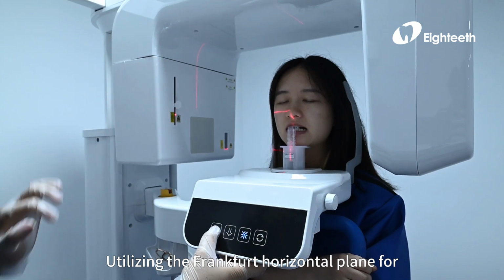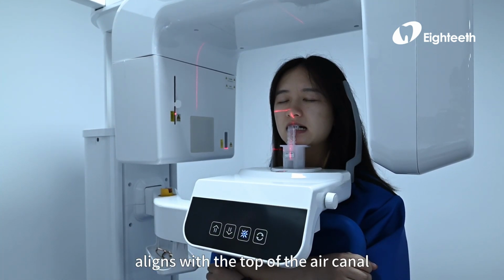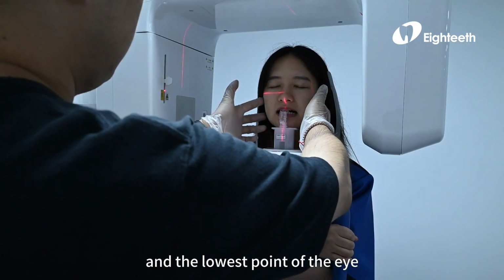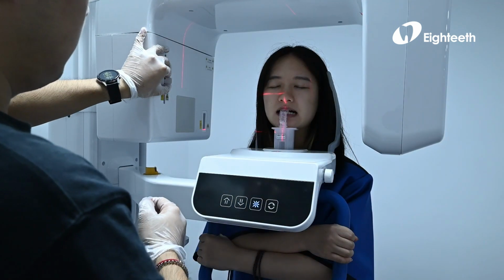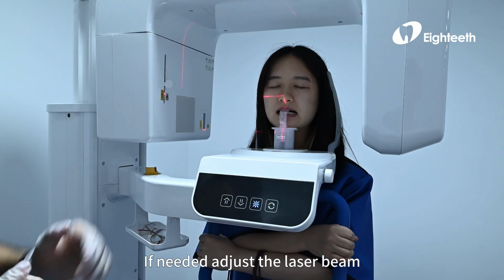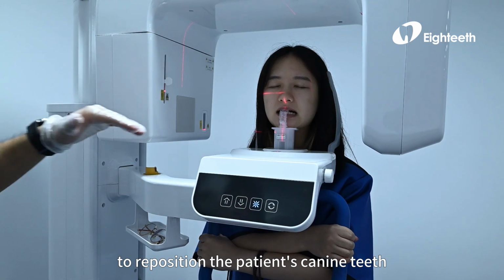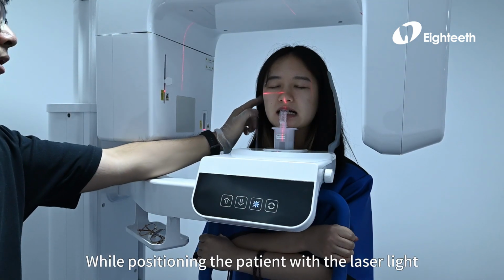Utilizing the Frankfurt horizontal plane for laser alignment. Ensure that the laser beam aligns with the top of the ear canal and the lowest point of the eye to position the patient. Ensure that the head support at the patient's temple area is properly fixed. If needed, adjust the laser beam to reposition the patient's canine teeth while positioning the patient with the laser light.